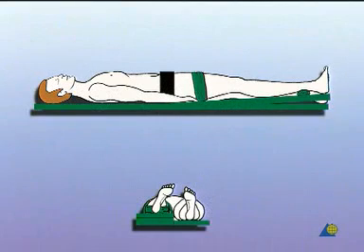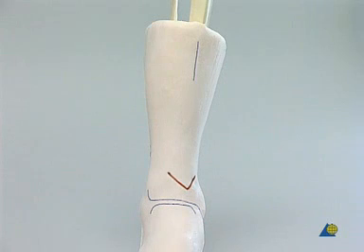The patient is placed in the supine position with a pad under his buttock to slightly rotate the leg internally. The leg is elevated or placed on a square cushion. A tourniquet is always applied, but only inflated if there is uncontrollable bleeding. If a bone defect is expected, the ipsilateral iliac crest is prepped so that an autologous bone graft can be harvested if needed. This exercise will be done on a foam-covered model that simulates the soft tissue cover. For better visibility, some sequences will be shown on a bare bone.